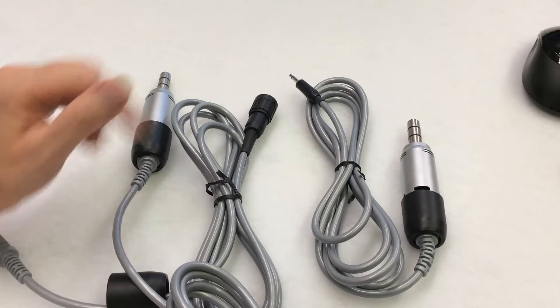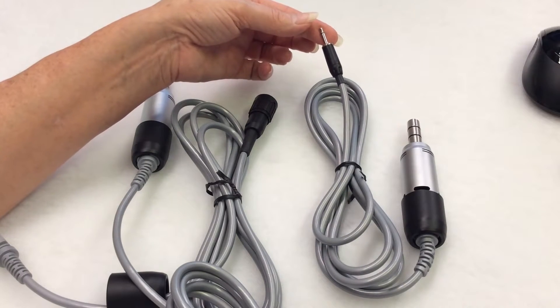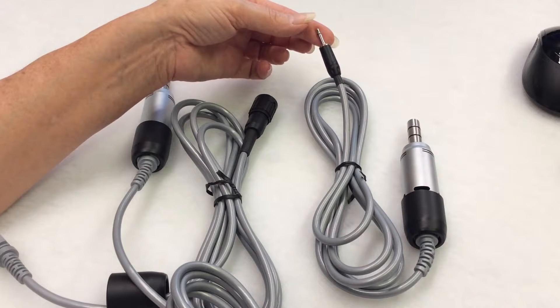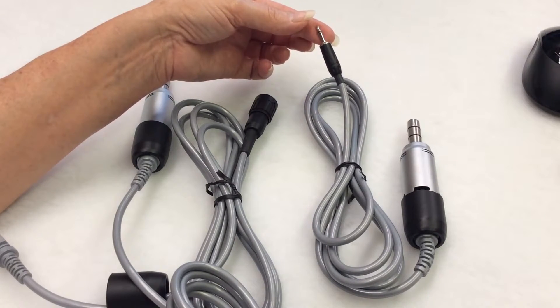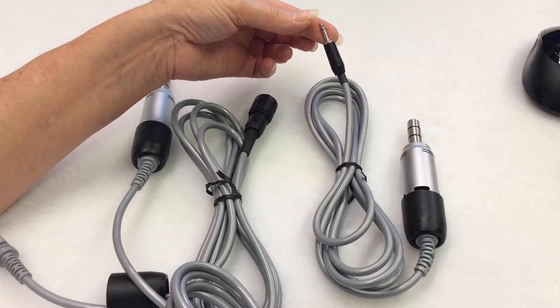If you need to order the one-pin phonotype plug-in cord — and you may want to write this down — the part number is P-RM-C-SP.